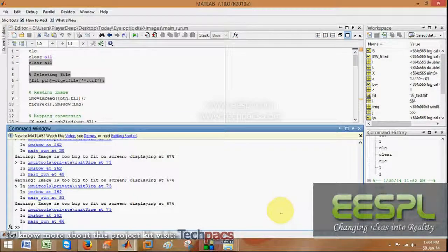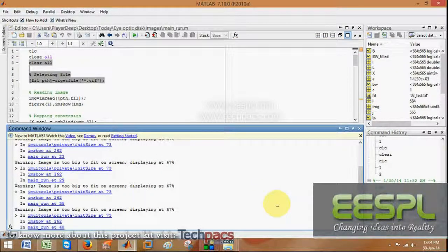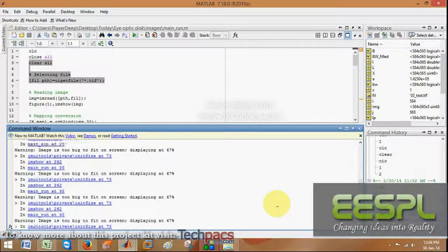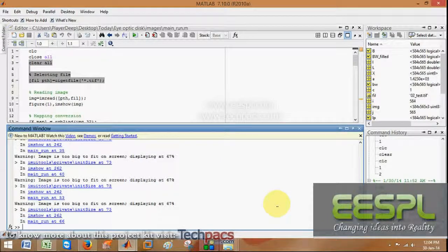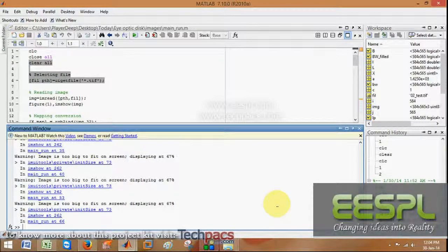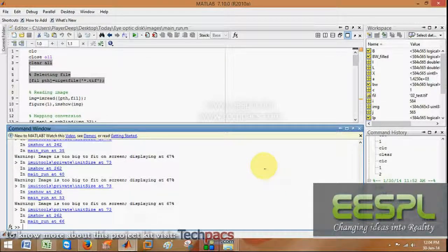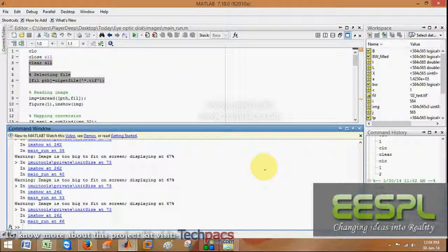So this is how we can detect the optic disc from the image. Hope this will be very helpful for you for disease detection and many more purposes. For more detail, contact us on www.eespl.com. I'll be back soon with a new idea. Thank you.